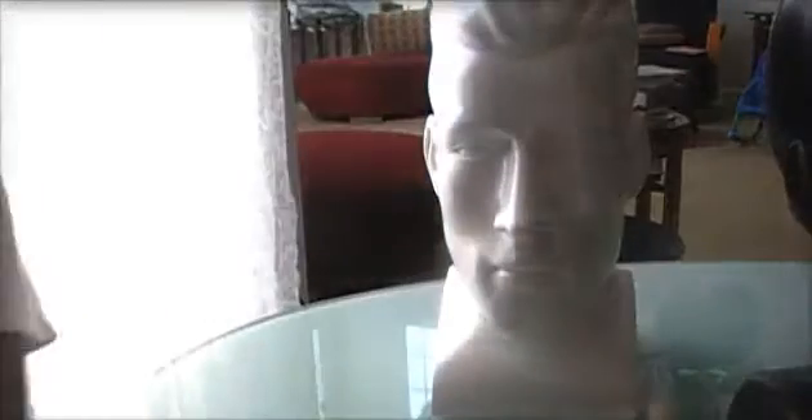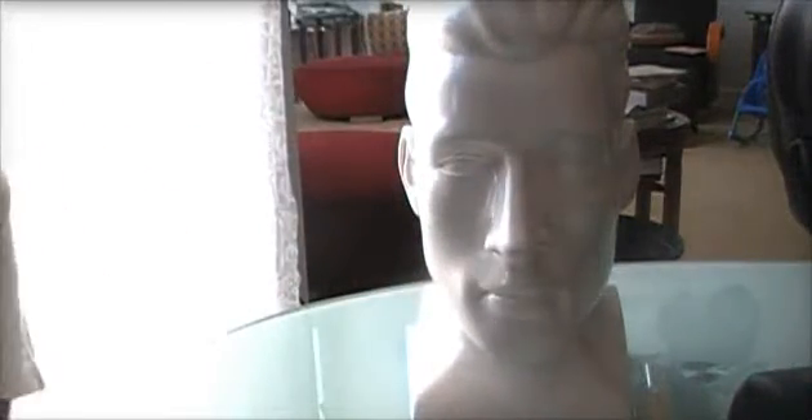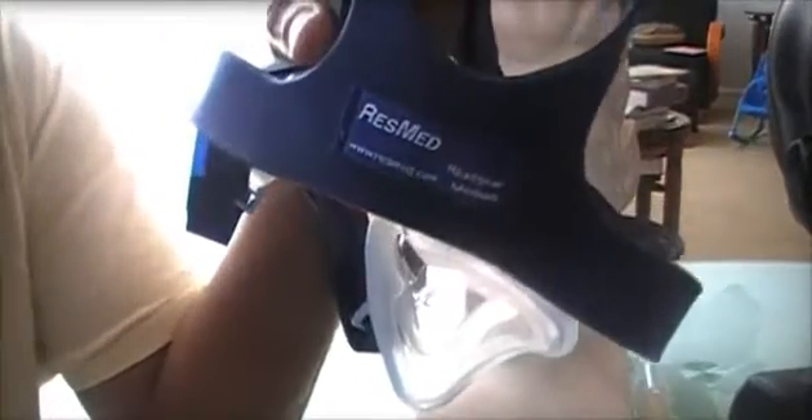Most manufacturers — for example, Respironics — make a one-size-fits-most headgear. If your headgear is too small, it will cause the cushion to press too tightly regardless of which manufacturer you use, causing bruising. Try buying a different size. ResMed, for example, sells headgear that comes in small, medium, and large. It will cost a little extra money, but it's worth doing.